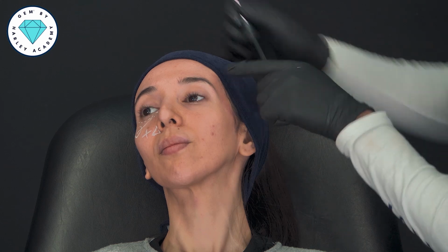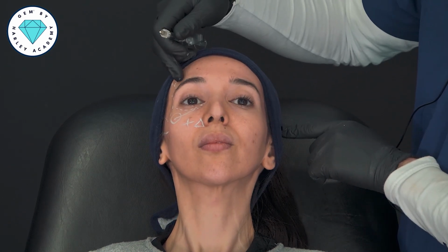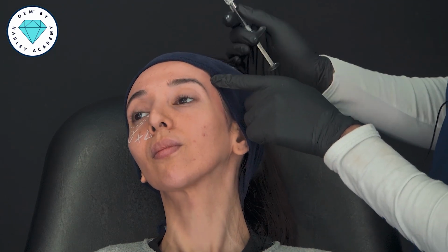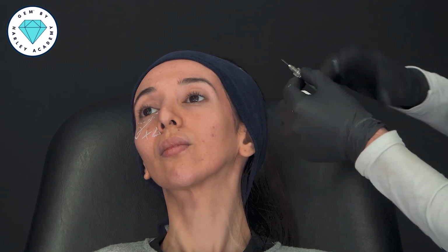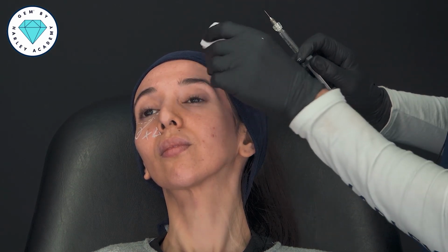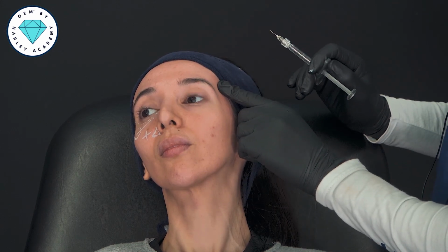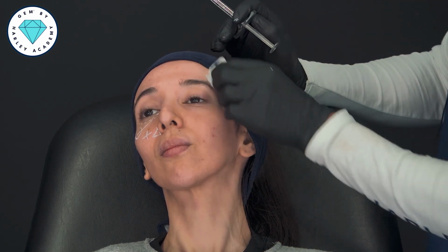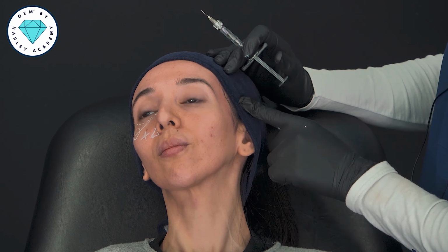And that's following the landmark that we have here. The reason this is an effective landmark, 1 up, 1 over, is because it finds the most superficial aspect of where the bone is to skin when the needle touches down on bone. But there's something else we can do, which is we can also aspirate. And that is also going to help us get more comfortable with the idea that we're not inside a vessel. Some injectors are also using an ultrasound machine to scan for the deep temporal arteries.